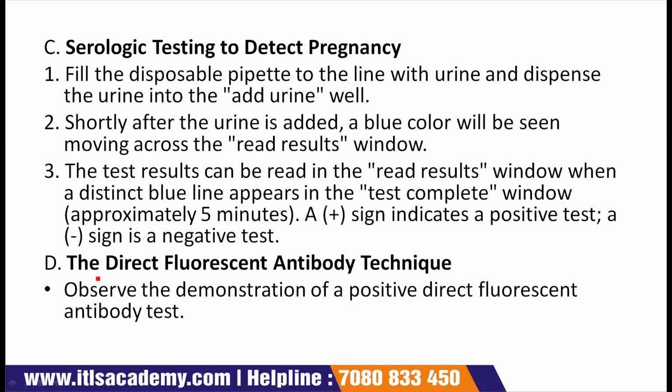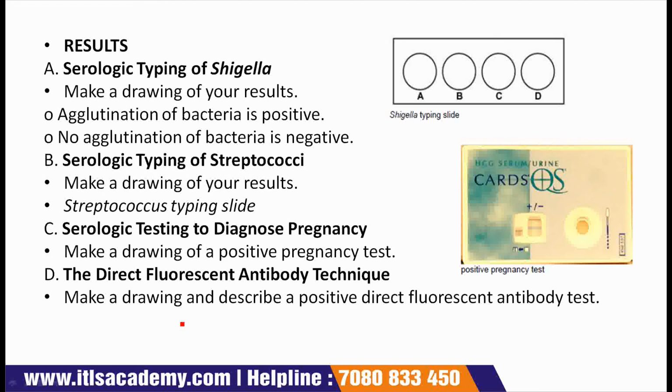Next one, the direct fluorescent antibody technique. Observe the demonstration of a positive direct fluorescent antibody test. For the results, first one, result for serologic typing of Shigella.